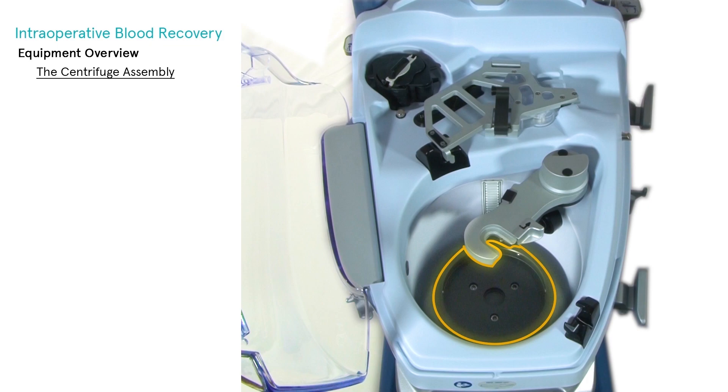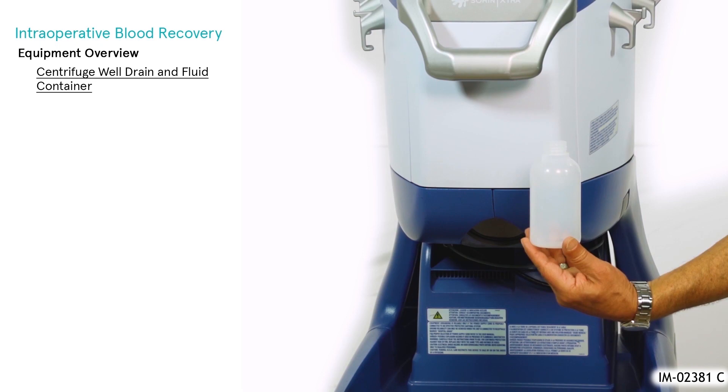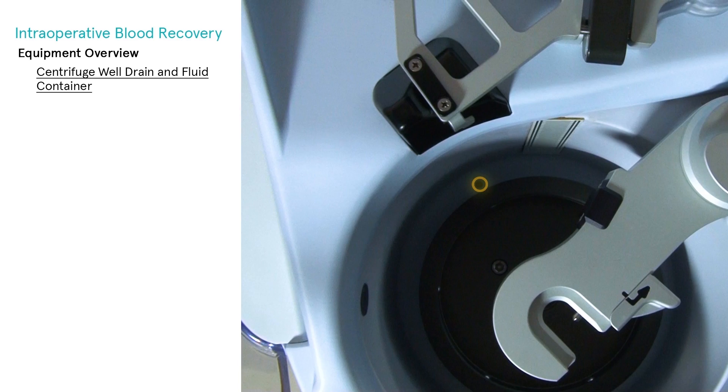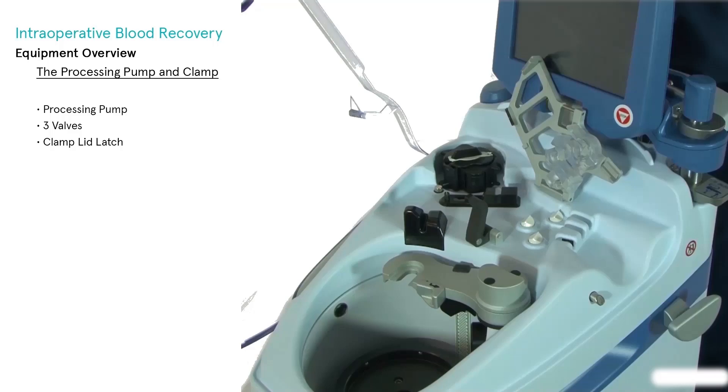The centrifuge plate rotates at a specific RPM during processing and is not operator adjustable. The centrifuge well fluid container is a non-sterile, 250-milliliter capacity container used to collect fluid, such as blood spillage, or fluids used in cleaning that may exit from the centrifuge well drain via gravity drainage. The drain is located in the centrifuge well, back left. The fluid container is located under the centrifuge well.